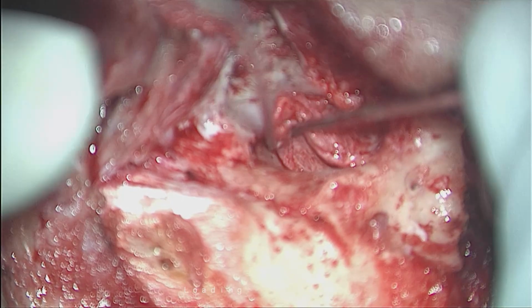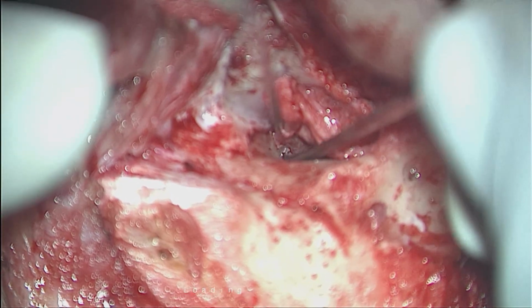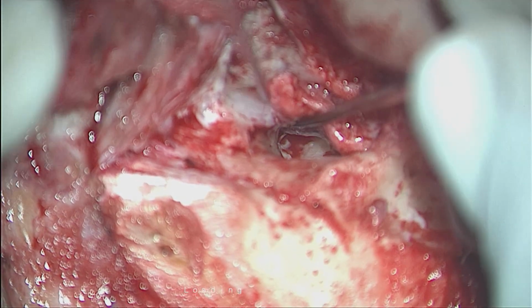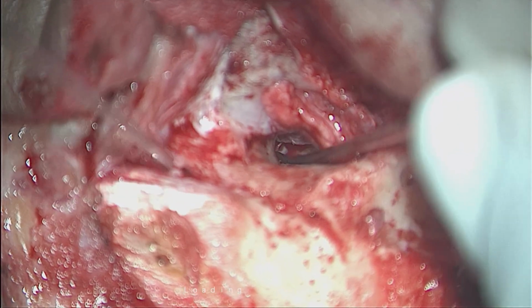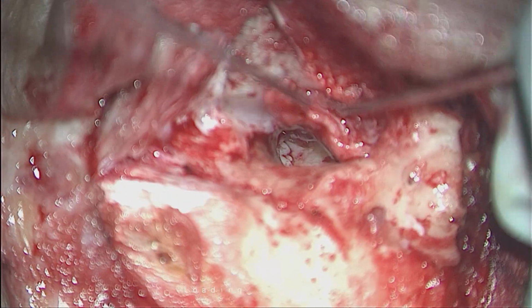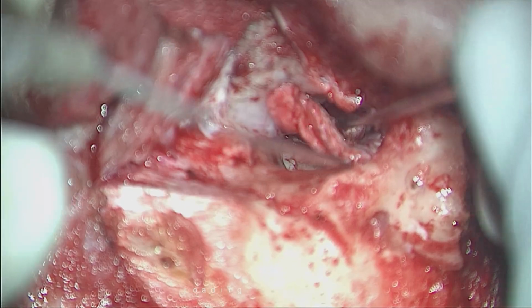So we have seen this inferiorly as well. You can see inferiorly, my graft is on the mucosa. Can you see the mucosal layer below? Very well seen, Satish. Yeah, and the graft is on the mucosa.